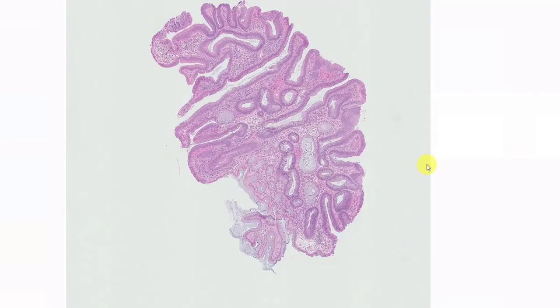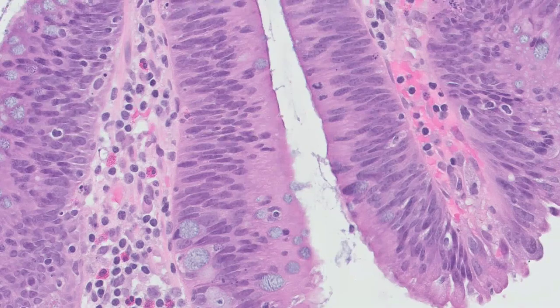And those are the two features I use on low power to make a diagnosis of a tubular adenoma. Then I go on high power. On high power, I'm looking for cells that are tall, dark — that means they're hyperchromatic — and they are stratified or pseudo-stratified.